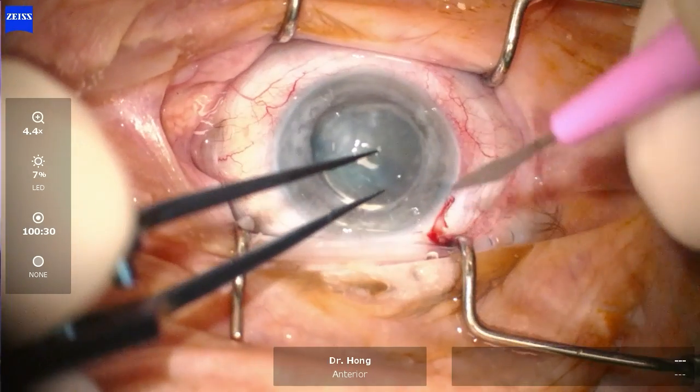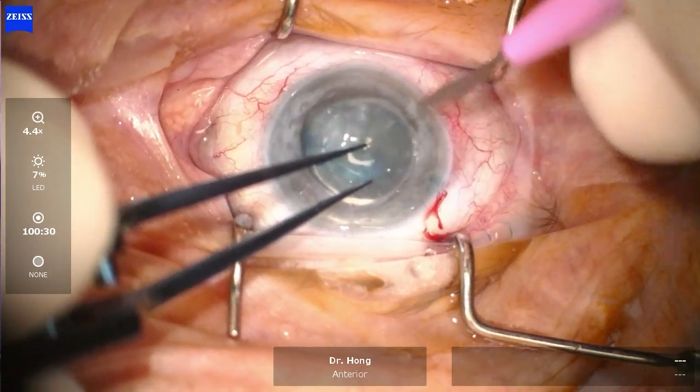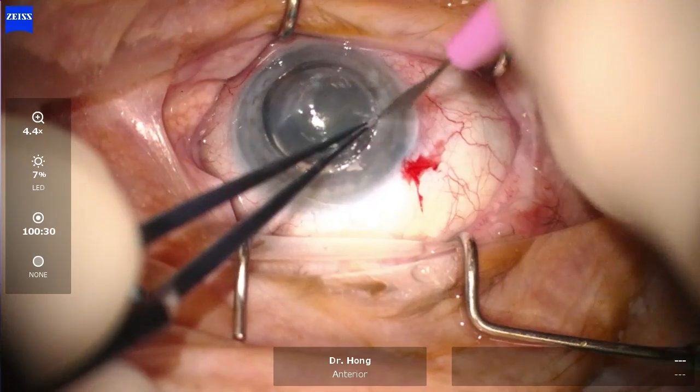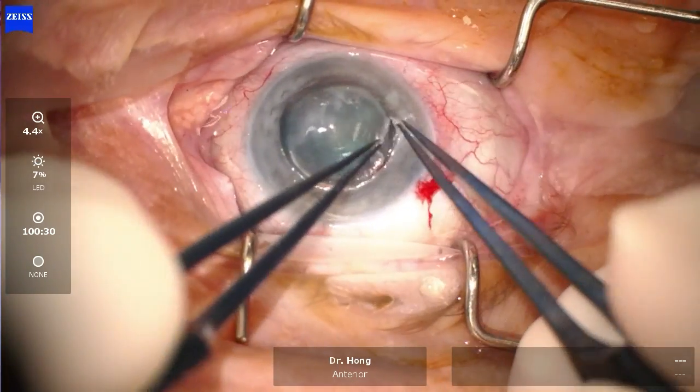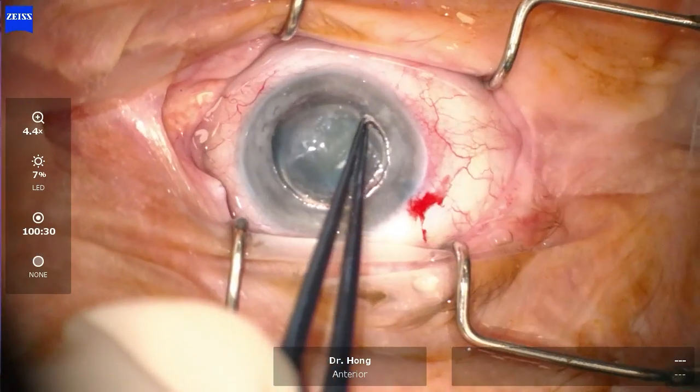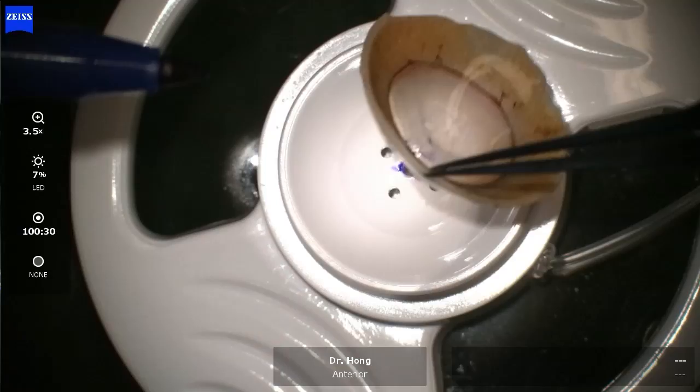As you can see, the patient has also developed significant ectasia at the graft-host junction, and some of the areas were extremely thinned. Using a blunt dissection technique, we managed to separate the old graft from the host tissue, and finally an entry point was made.